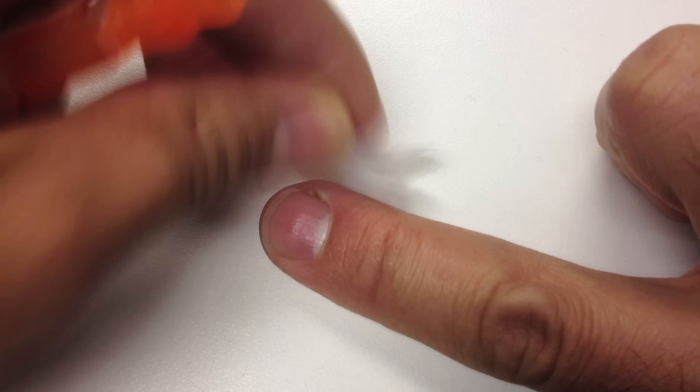You see that spot with the numbing. Now, I'm right-handed, so this is going to be a little shaky going in. But if I can do it with the left hand, I can do it with anything.